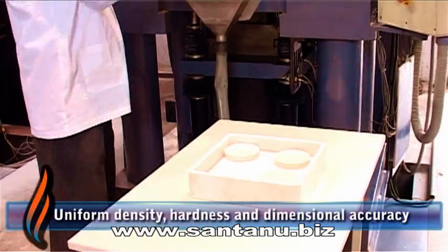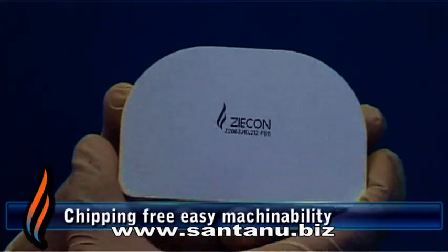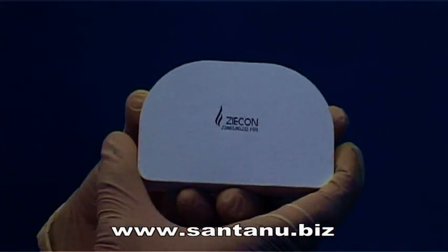Ensuring uniform density, hardness, dimensional accuracy and chipping-free smooth machining of each blank.